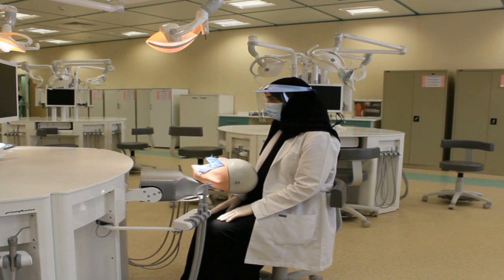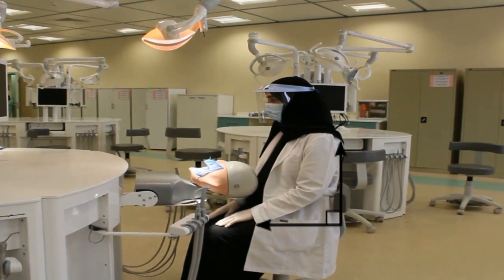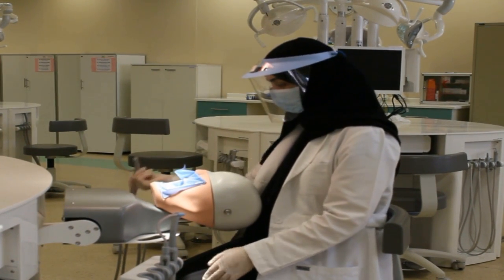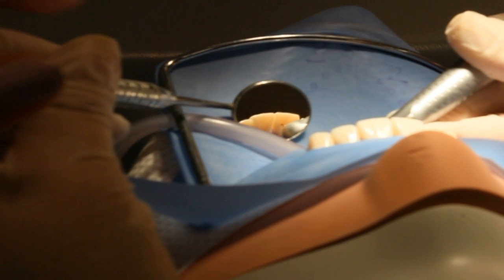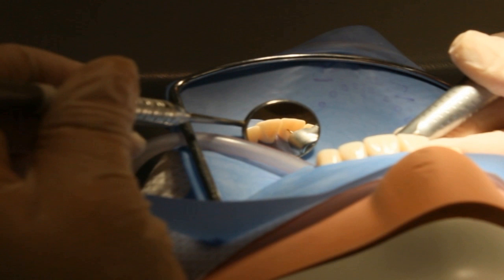Before we start any procedure, we have to wear the face shield, the face mask, and the gloves. The back of the operator should be straight, the head erect and not bent, the forearm and the thigh parallel to the floor, and the elbow at the level of the teeth. Class 3 needs indirect vision, 12 o'clock position, and the mirror needs some modification to have clear vision.